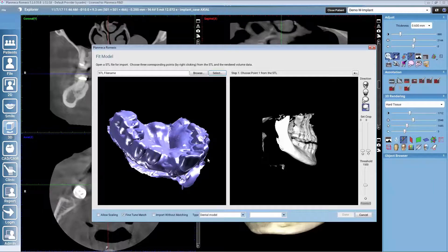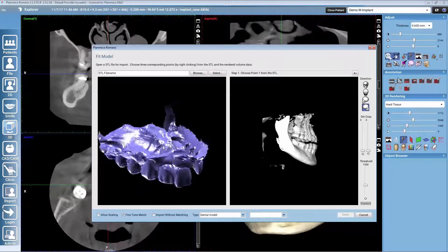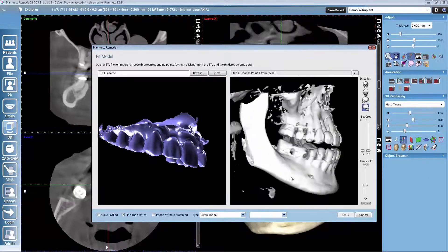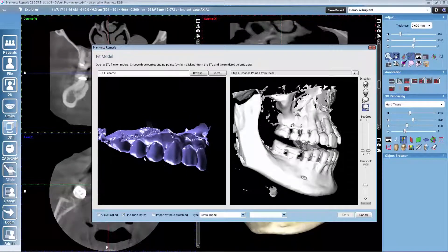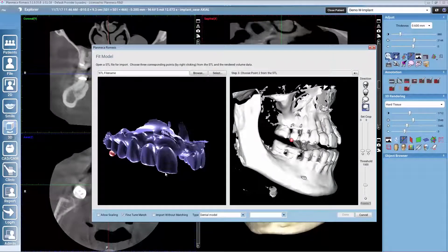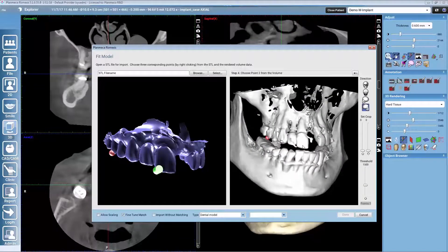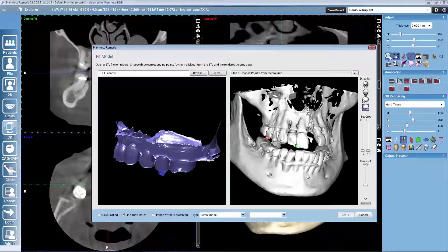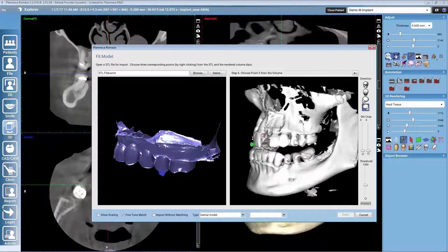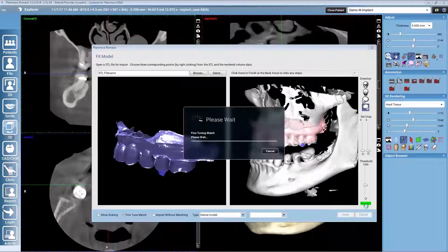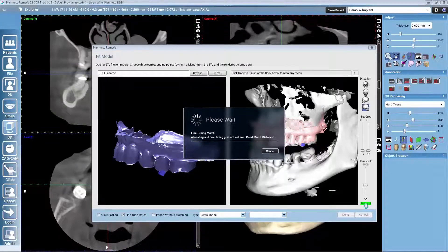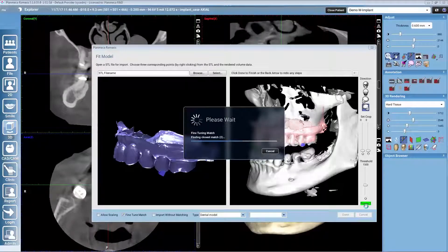We need to give three points in common for Romexis to do the mapping, and we try to select the points as far away from each other as possible. We always select one point from the left side image and then the same from the right side image. Romexis will not only use the three points given, but will use a special algorithm to make the match even better.